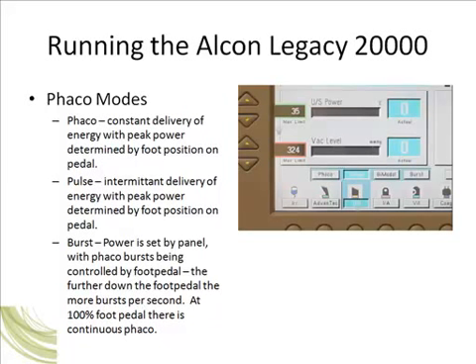Burst mode is another, but in pulse mode, it's important to note that your pulses are continuous. They are set by the panel, and whenever you enter foot position 3, there'll be a given number of pulses per second, 2, 4, 6, 8, or whatever you set on the panel. As you depress further in foot position 3, the phaco energy will linearly increase until you hit the maximum preset level on the panel.